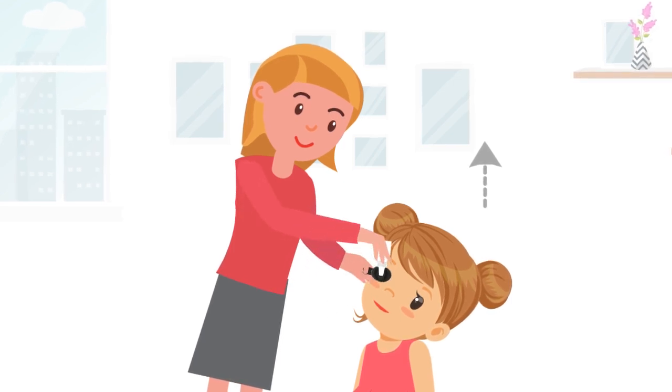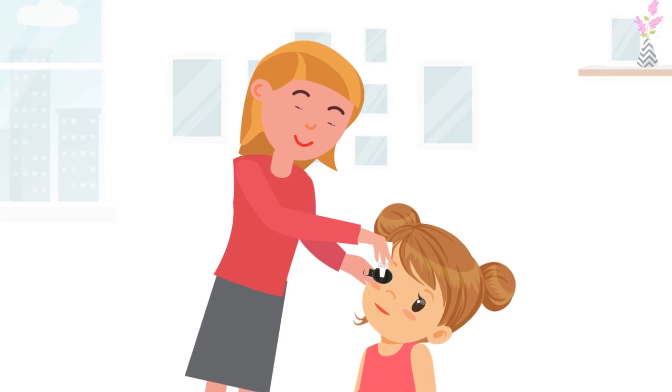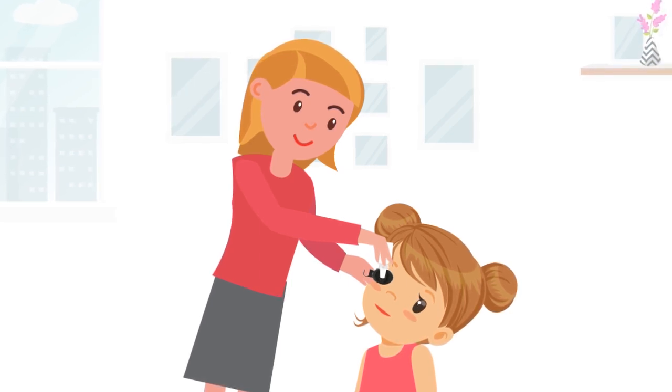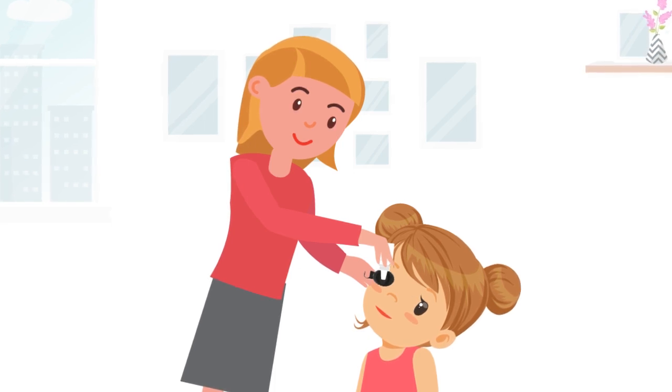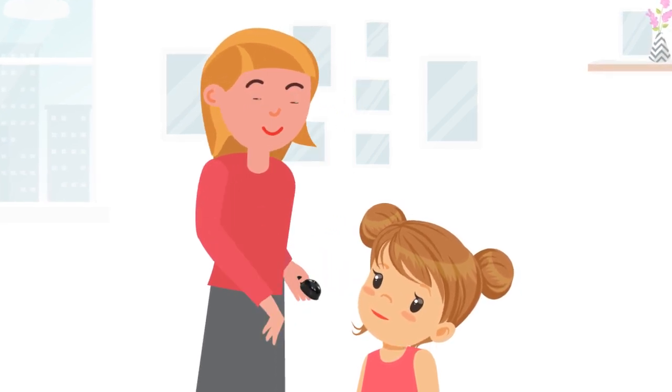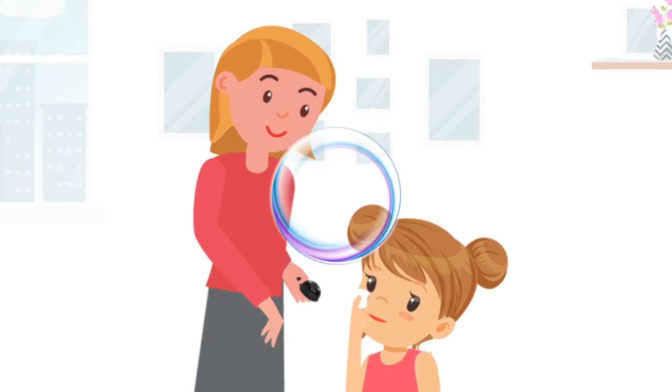Gently place the bottle and applicator onto the eye, and gently squeeze the bottle, ensuring that they are looking up with both eyes open. At this point, many individuals will flinch the moment the drops hit the eye, prompting you to raise the applicator back. Ask the person to wipe off any excess liquid, and you're done.